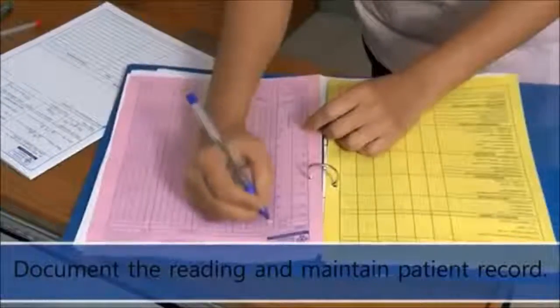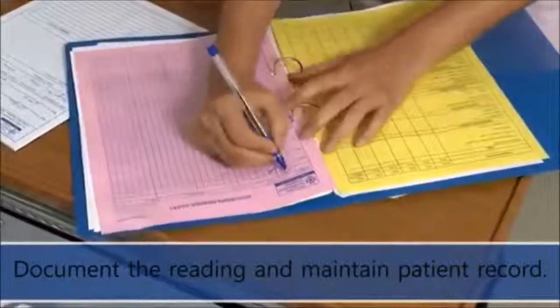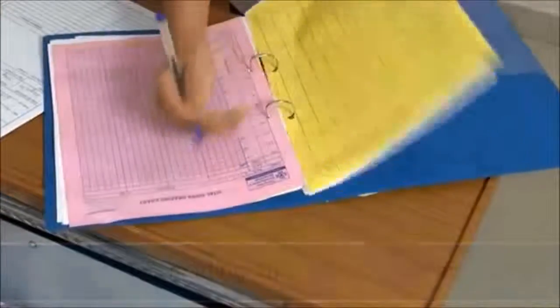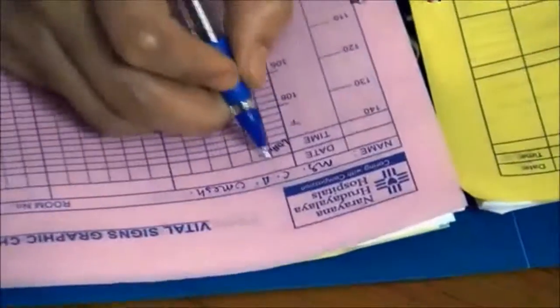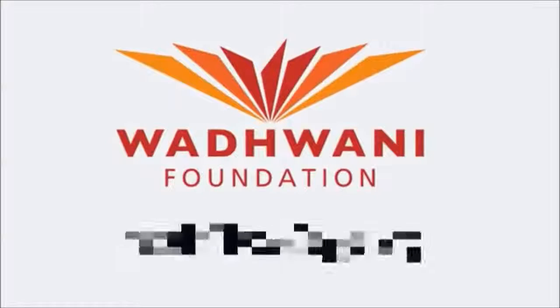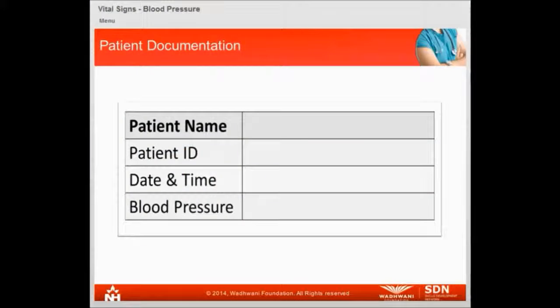Document the reading and maintain patient record. Always remember to complete your documentation after the procedure.